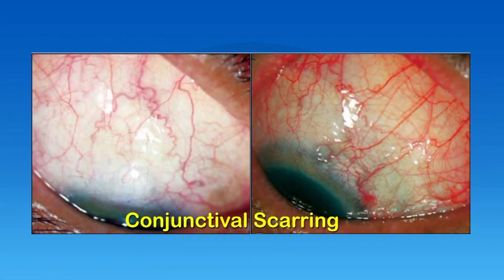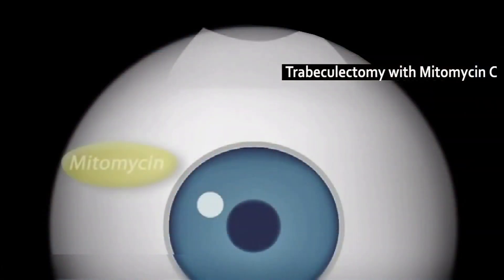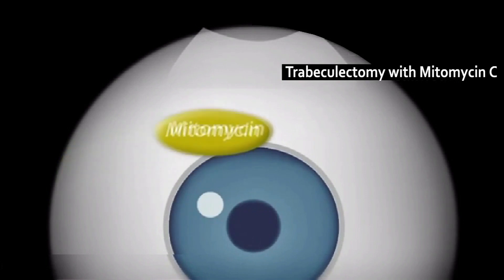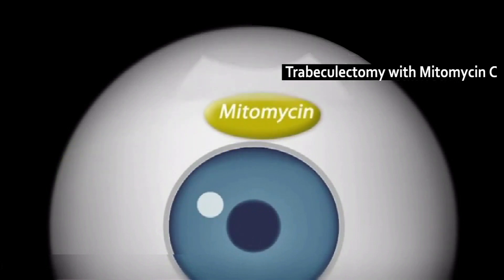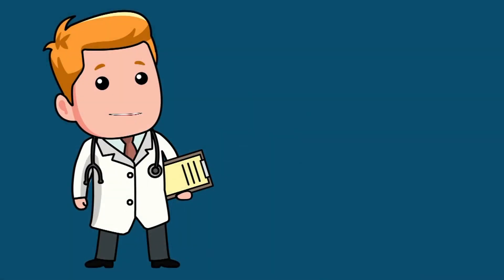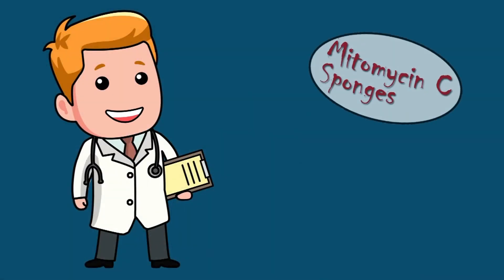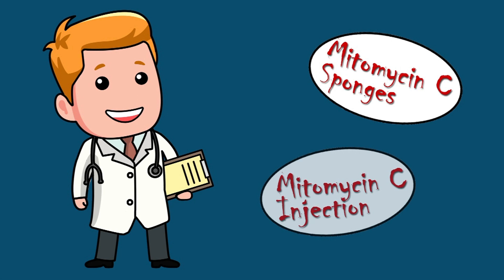Conjunctival scarring is one of the difficulties associated with glaucoma surgeries such as trabeculectomies. However, an effective way to control scarring is the application of mitomycin C. Here is the video eliciting two possible ways to apply mitomycin C during a trabeculectomy.